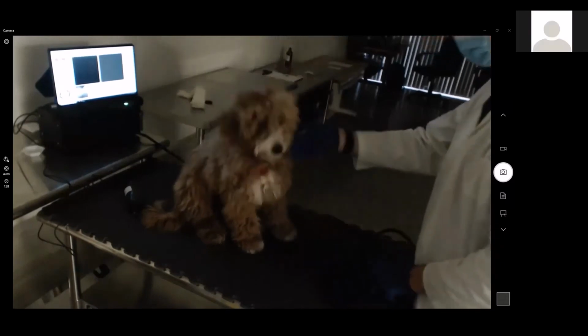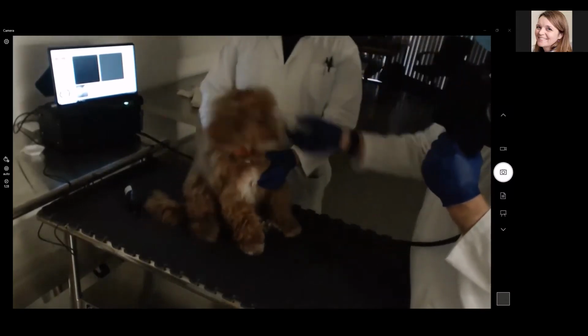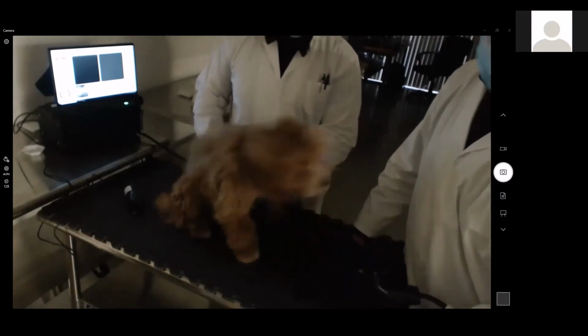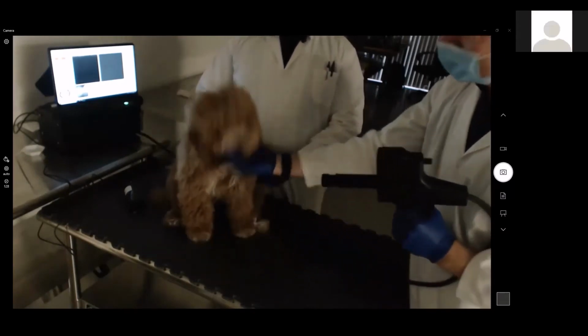Okay, how about that? Did that? Yep, that's working. He's very wonderful. He's very cute, but not as cooperative as Neuron. No, you know, Neuron is absolutely the best dog ever. Yeah. But I don't want to use him. He's getting old now. I got to get a new dog in the works here.